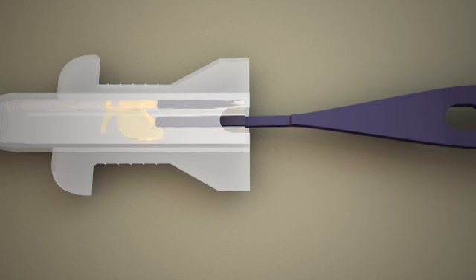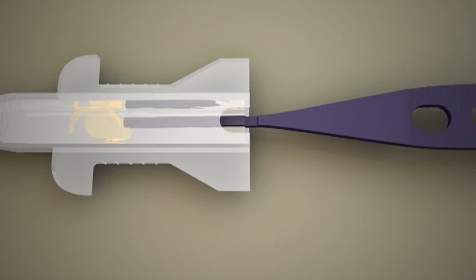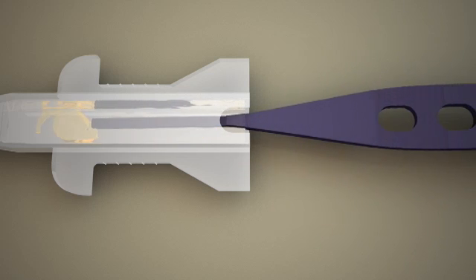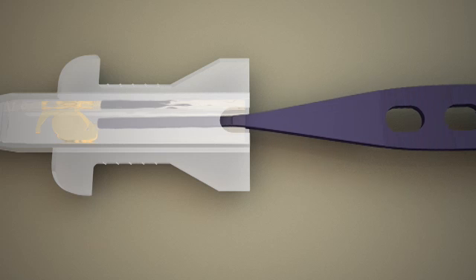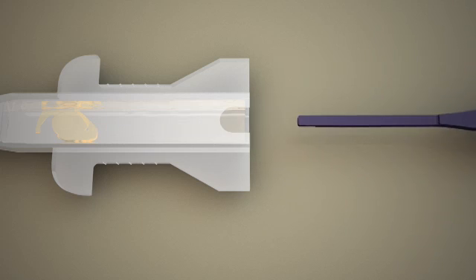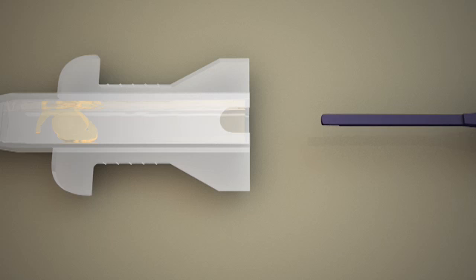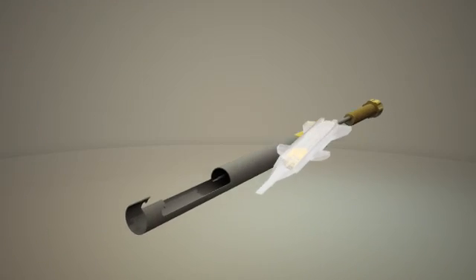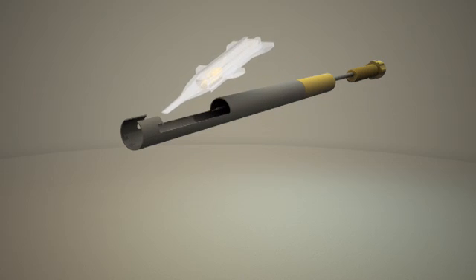Push the forceps into the cartridge as far as possible. Retract the forceps, leaving the lens in place, then insert the cartridge into the handpiece.